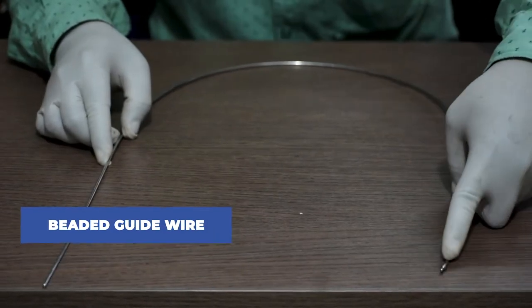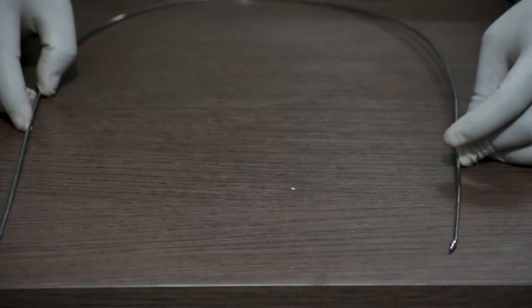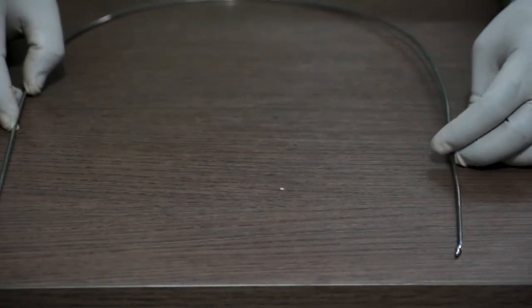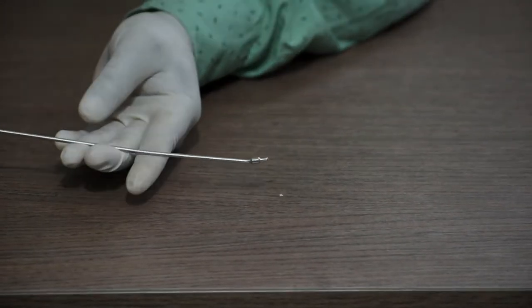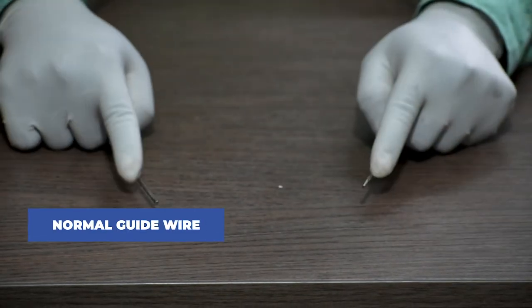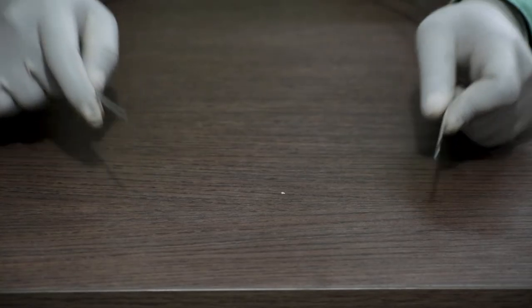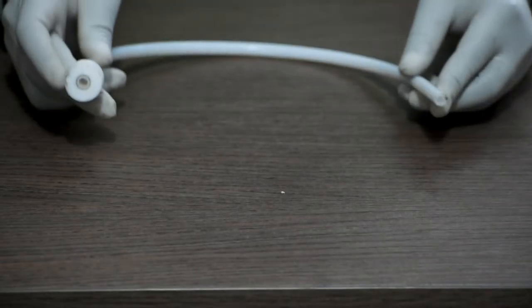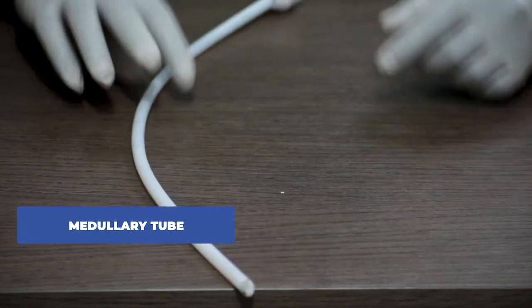Next is beaded guide wires. It's a long guide wire. See, this is the beaded region. Next is normal or plain guide wire. As you can see, there is no beaded region for this guide wire. This is called a medullary tube or an exchange tube.